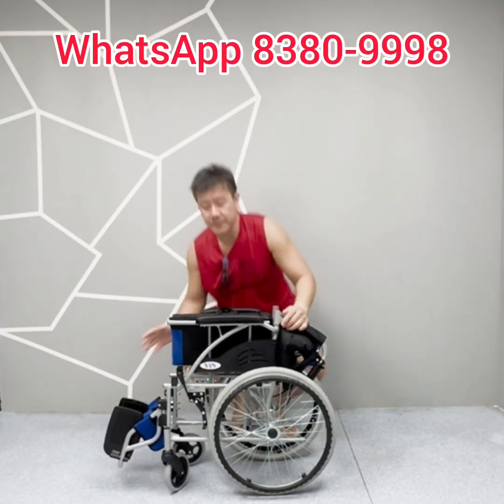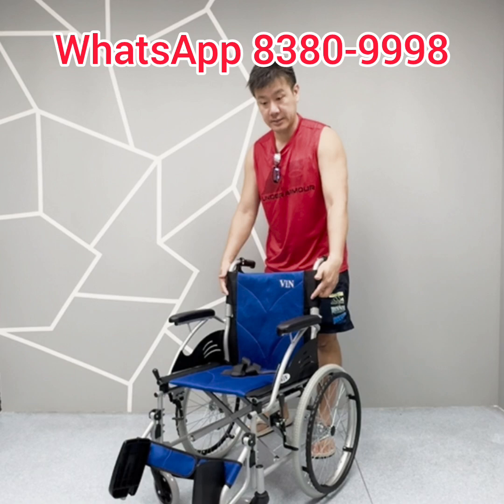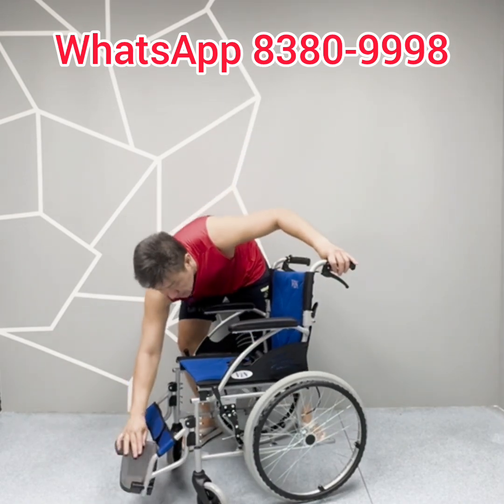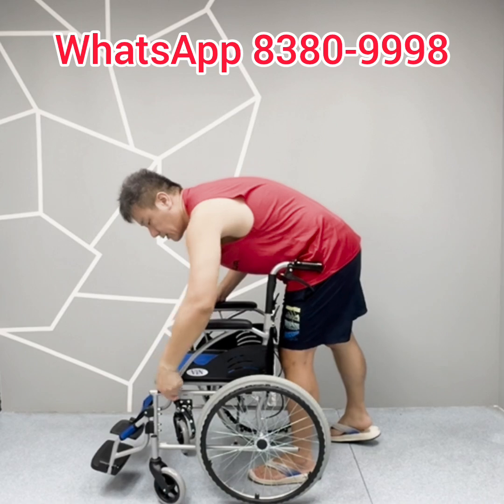To open the wheelchair: flip down the footrest, press out the seat, flip up the push bar, loosen the latch. Then flip down the foot pad. The wheelchair features braking systems including an attendant brake.